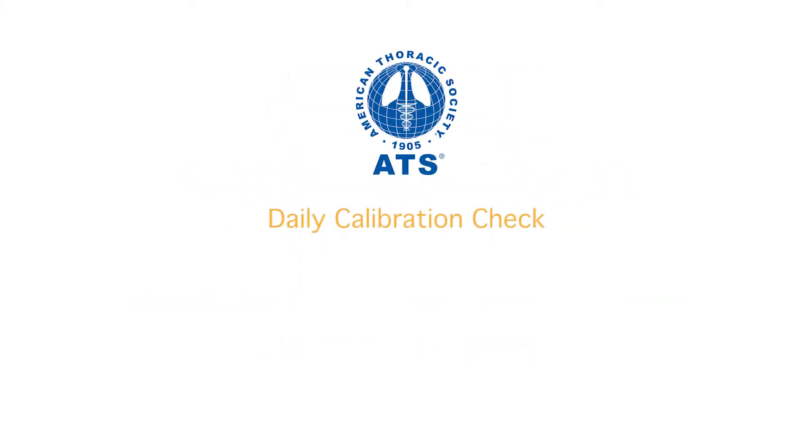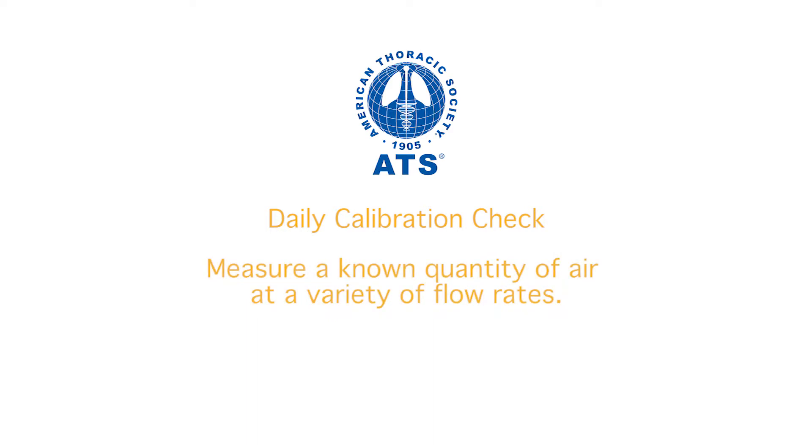The American Thoracic Society recommends that a calibration check be done daily before using the spirometer. The purpose of doing a calibration check is to verify that the spirometer can measure a known quantity of air at a variety of flow rates. For flow spirometers like the MIR spirometers, we need to check the calibration at three flows: high, medium, and low.